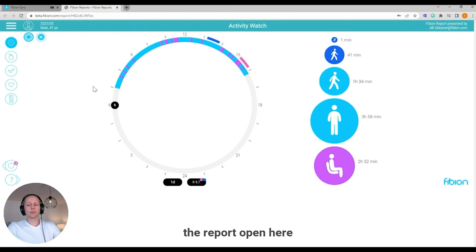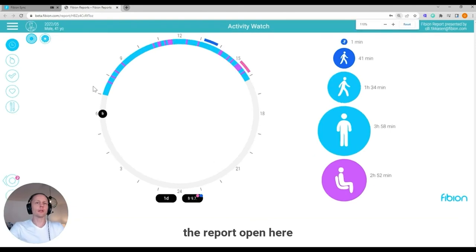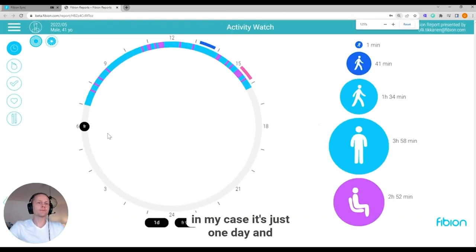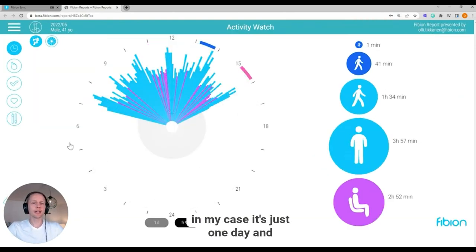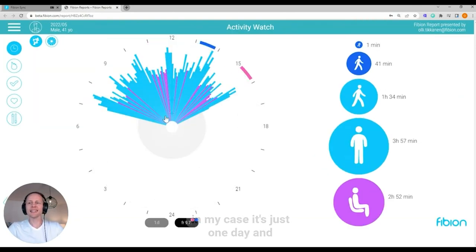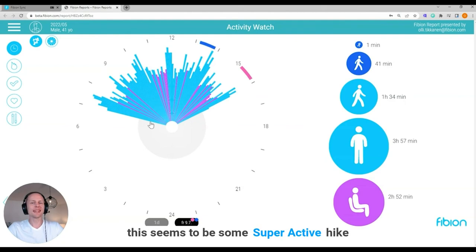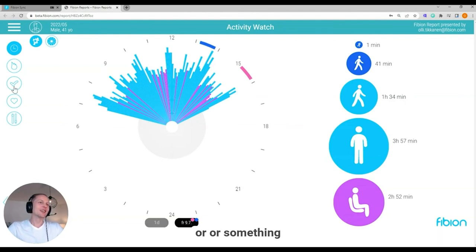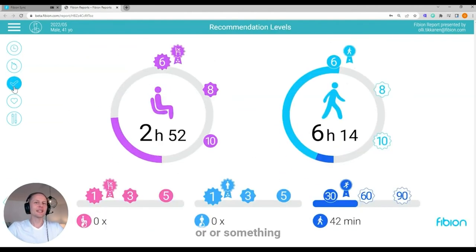And now I have the report open here. In my case, it's just one day and this seems to be some super active hike or something. But I can see the different things in the report.